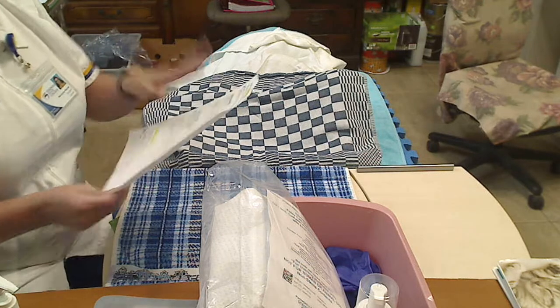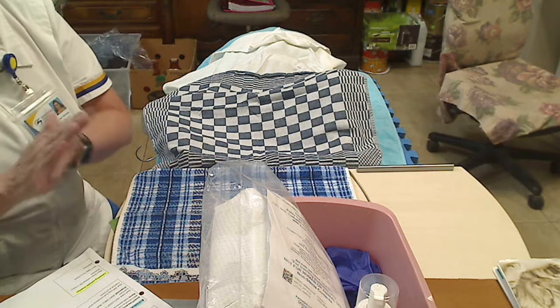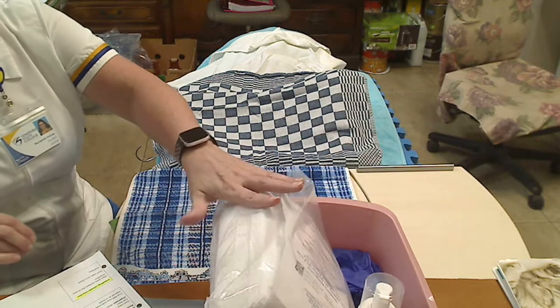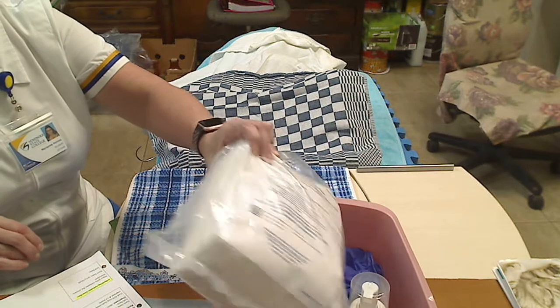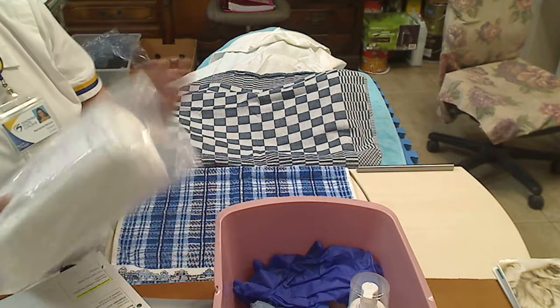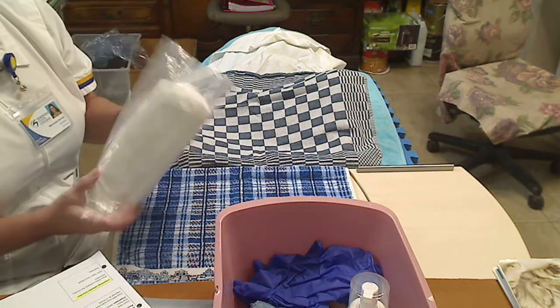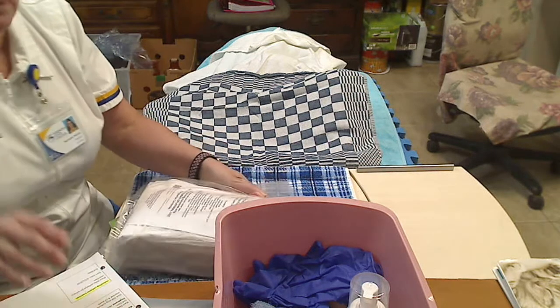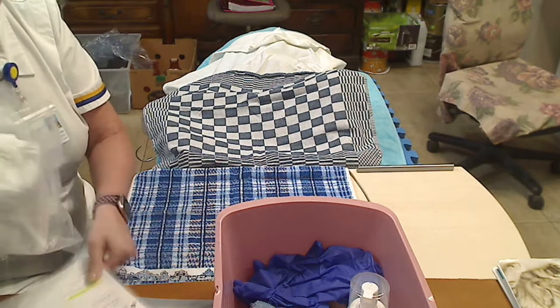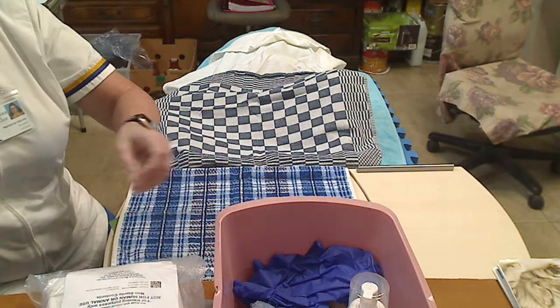Now that I have this, I will do my second set of rights while I am in here. Again, I will hand sanitize. And I will confirm Anna Povolowski, 5/5/1957, penicillin with a reaction of hives is in fact due for an indwelling catheter insertion. So again, I'm confirming I have the right kit, right patient, and right times. So I've done my second set of rights to confirm that I am doing what I am supposed to for my patient. I'm going to set my rights off to the side.